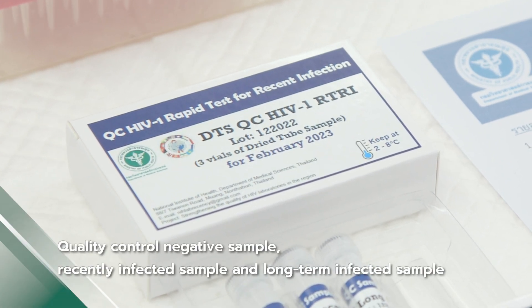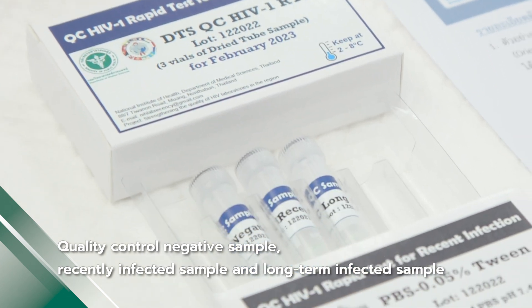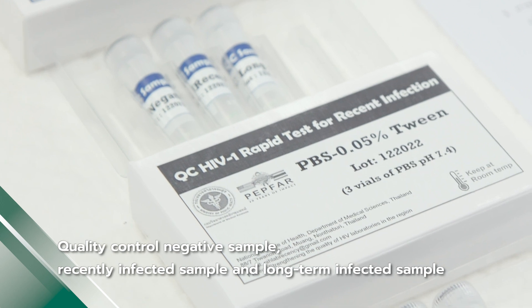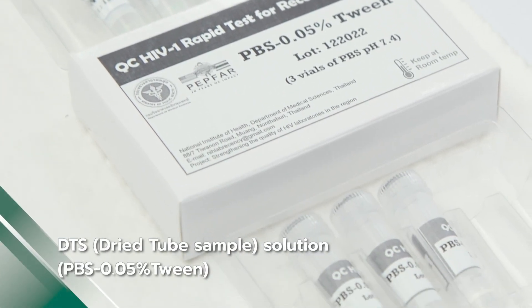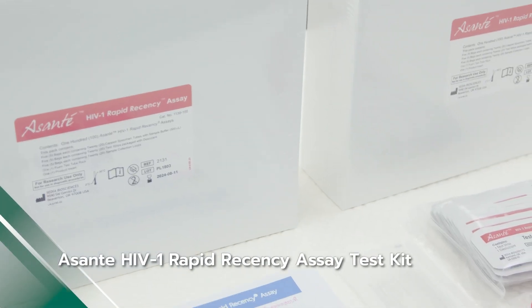Materials needed: quality control samples for negative, recently infected, and long-term infected samples, and DTS or Dry Tube Sample Solution 0.05% Tween.